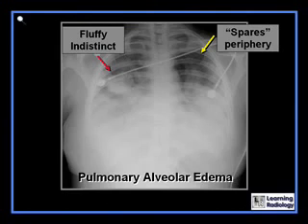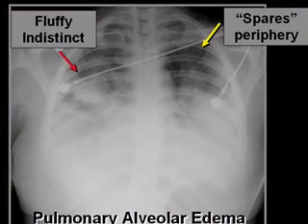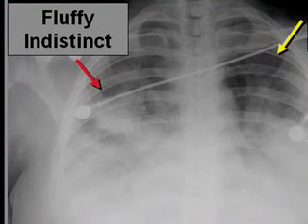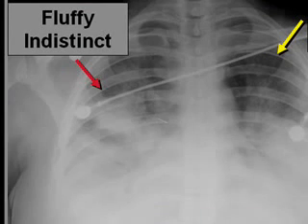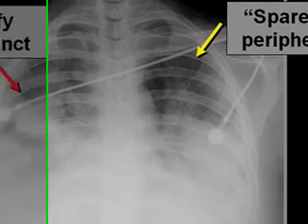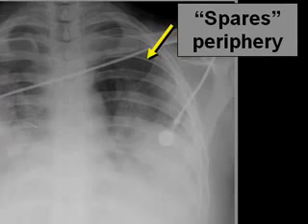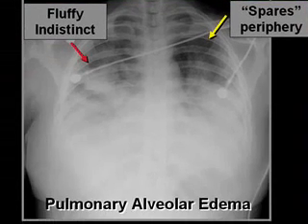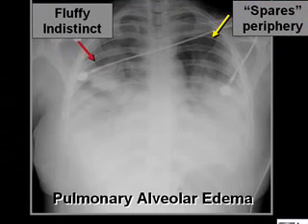Just a few words about pulmonary alveolar edema, usually just referred to as pulmonary edema. When the fluid in the interstitium spills out into the alveoli, it produces fluffy, indistinct, confluent opacities in the lung, which look quite different from those of pulmonary interstitial edema. There is a tendency for pulmonary edema, especially as it relates to congestive heart failure, to spare the outermost portion of the lung, though this is not always true. This is an example of pulmonary alveolar edema.